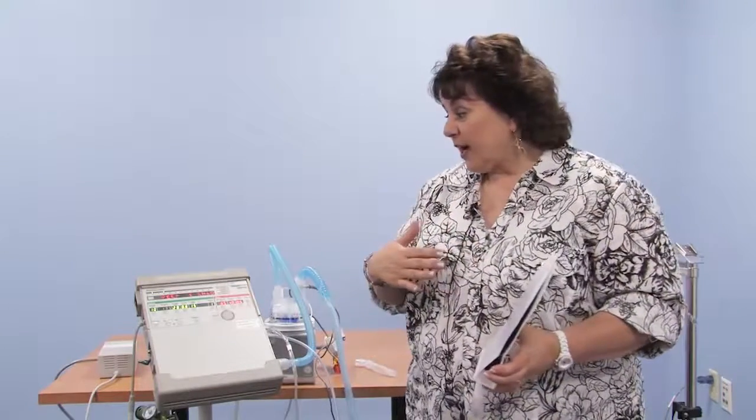So if your child does not breathe at all, they will receive 10 breaths. But if they're breathing actively, the machine will allow them to inhale and try to give the breath in with them comfortably. So the two of them are together with their breathing. In between those 10 breaths, your child can take as many breaths as they would like, utilizing the pressure support, another predetermined setting which helps them overcome resistance of breathing through a tracheostomy tube with whatever breathing problem that they have, whether it be lung or muscle issues that make it difficult for them to breathe without assistance of the ventilator.